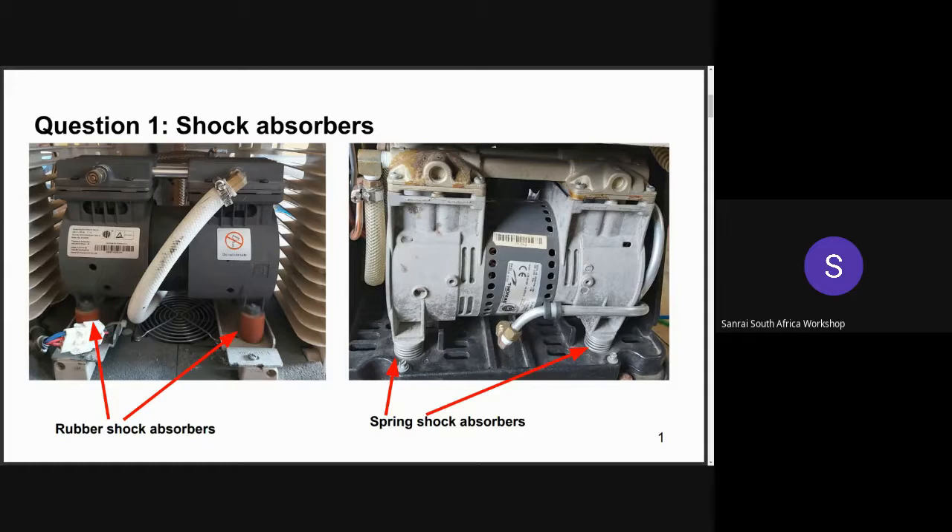Sometimes the threaded hole where the stem screw attaches to the compressor gets damaged or enlarged, and the screws will not be able to fasten the compressor, causing it to vibrate. Another possible cause is when the relief valve on the compressor is faulty and pressure builds up, causing unusual vibration and noise. However, since pressure affects purity and purity was not affected in this case, the vibrations are most probably from the shock absorbers.